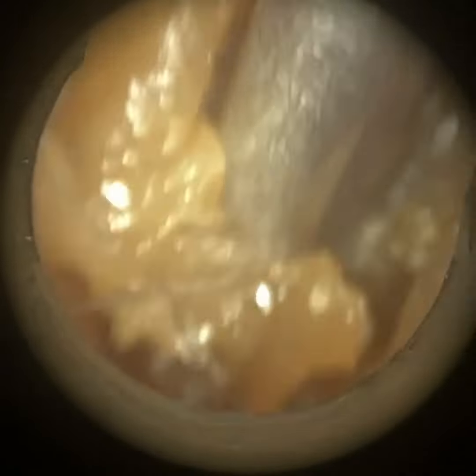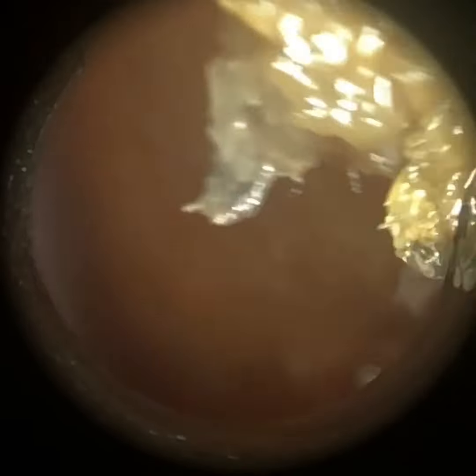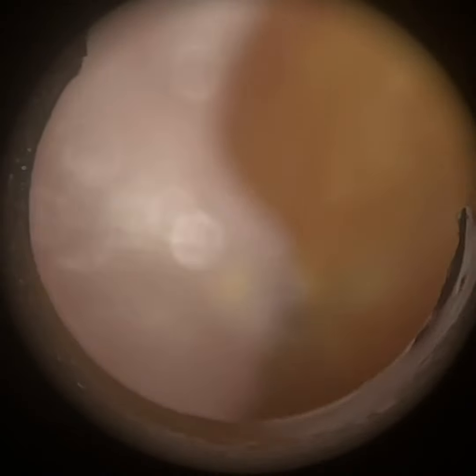Once you're in there the ear canal is quite wide, so I'm just trying to get a suction grip and wriggling this with little circular movements. That helps to continue to separate the wax keratin plug from the canal wall and also retrieve the wax out of the ear. That's the first bend just to the right, and it was quite a substantial plug at the end — I've got a still image so you'll be able to see it.